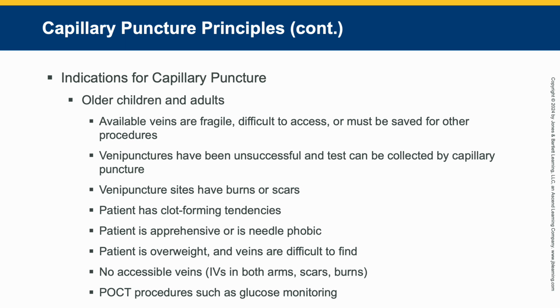Another reason that is acceptable is if your patient has lots of burns or scars. That will make it hard to get to their veins and painful if they're burns. If they have clot-forming tendencies, so again, if they are a thrombotic type patient, which has clots a lot, in this case, then you would do a capillary on them.